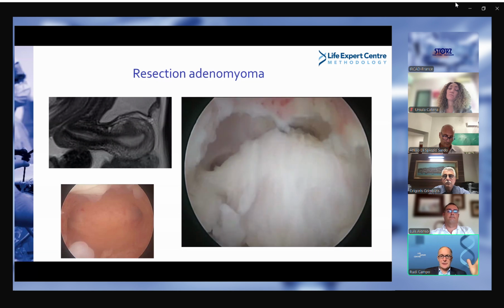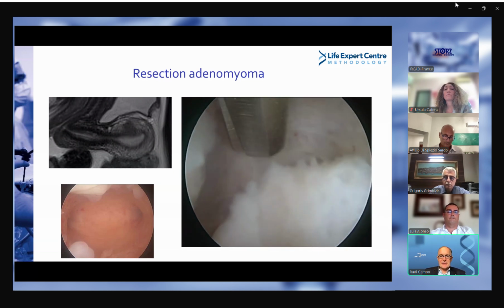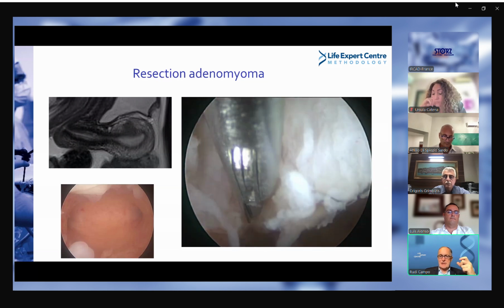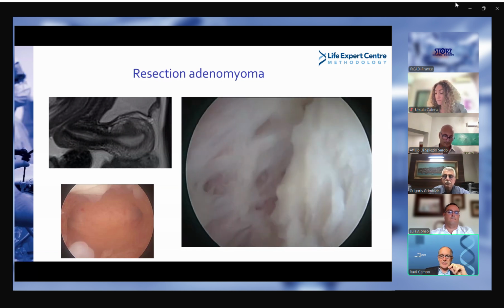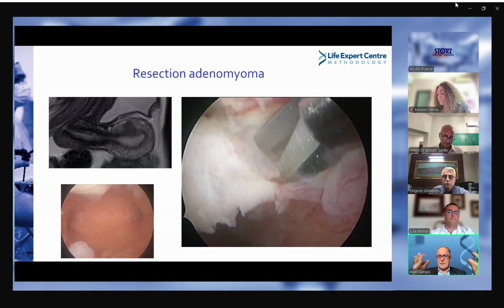The technique for those simple lesions: you see in hysteroscopy, you don't see anything. In MRI, you have a GPS, under ultrasound guidance. For this reason, in your OR, you should have permanent ultrasound integrated and high-tech ultrasound. And you go and you find fibrotic tissue and surrounding tissue.